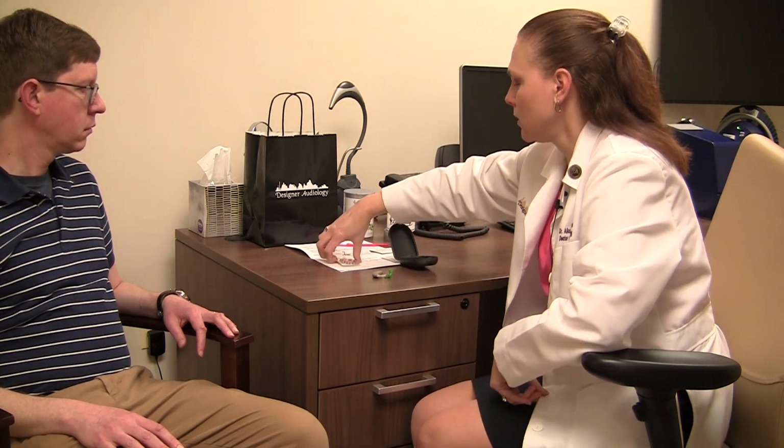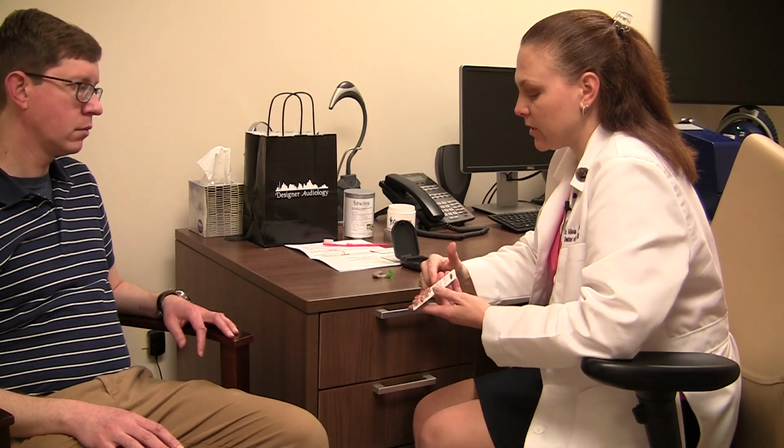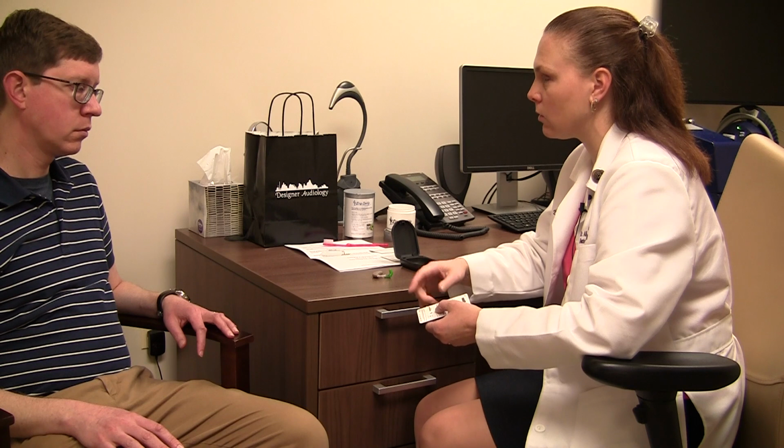Couple things. Your batteries to get started are going to be size 13 batteries. They're always going to be color-coded orange no matter where you purchase them, and they're always going to be 13. Somewhere on the battery pack there's an expiration date, so you can see these are good through October of 2023. My recommendation is that when you buy batteries, make sure they're good for at least 1 full year. So you don't want to buy anything earlier than March of 2021 to make sure that they are good.